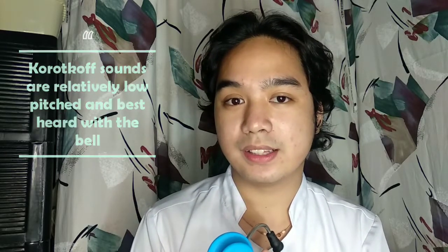So the next step is to position your stethoscope over your brachial artery. So here is my stethoscope. Your earpiece ear tubing should be in the same direction as your ear canal, so that you can clearly hear the Korotkoff sounds. And you will use the bell, because Korotkoff sounds are characterized by a low pitch sound. The bell would amplify that sound so that you could hear clearer and have accurate measurements.